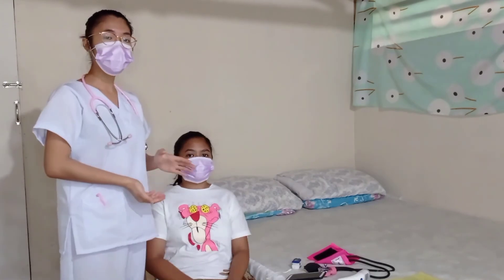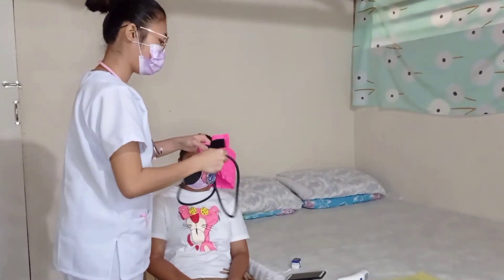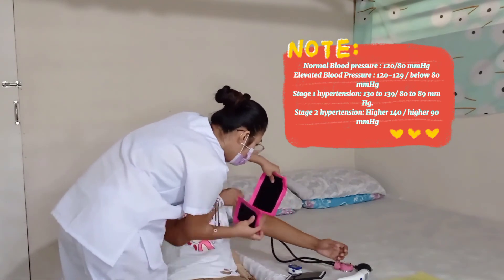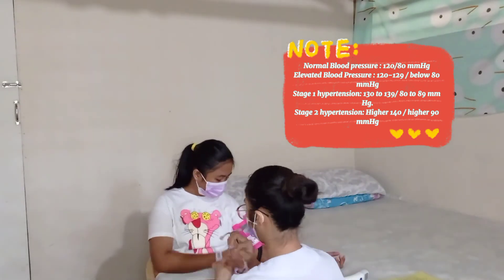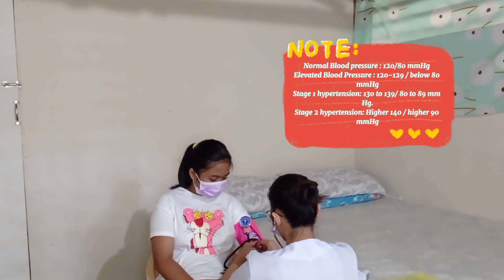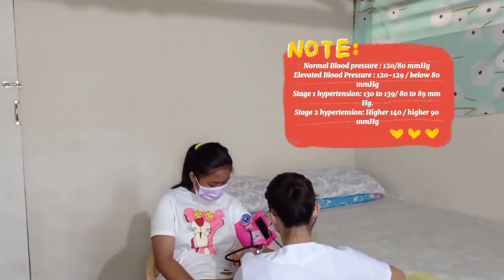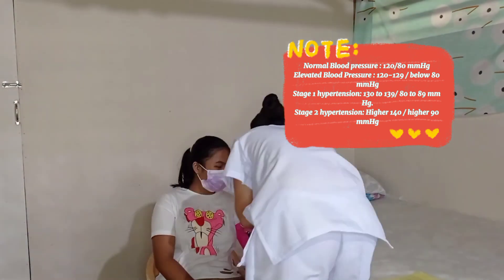Her pulse rate is 70, which is normal. Now I'm going to check for blood pressure. Her blood pressure is normal.